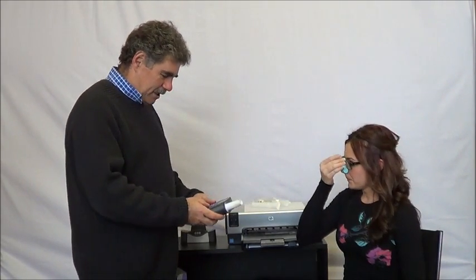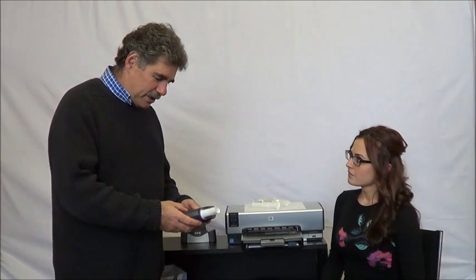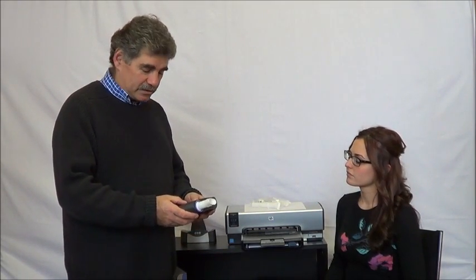Session complete. Great job — Grade A. Session is done.